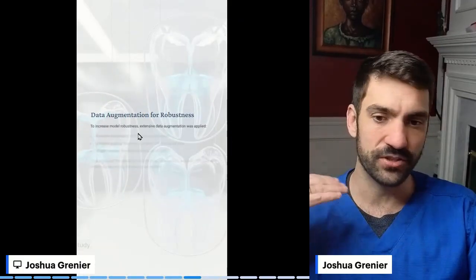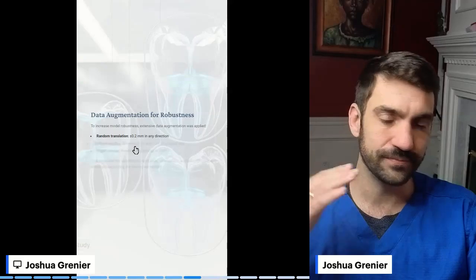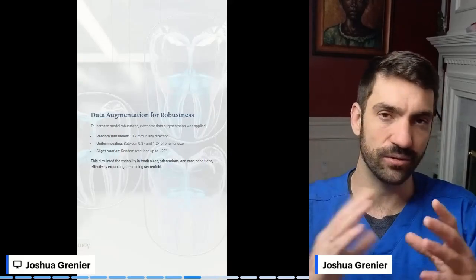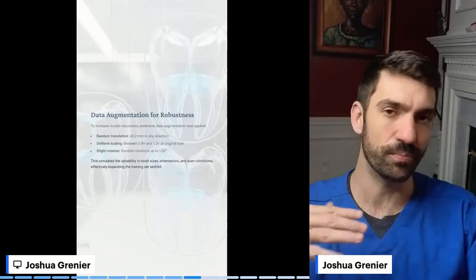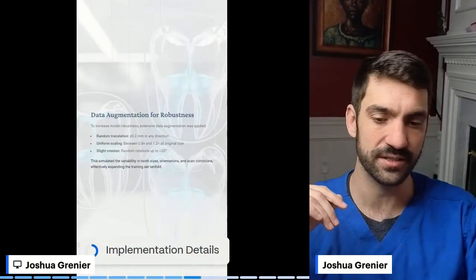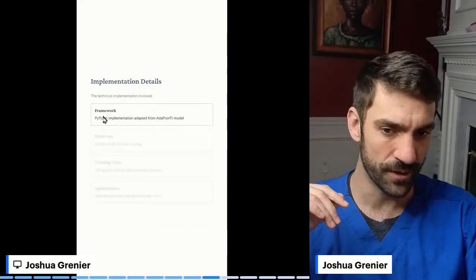And again, they try to stretch the model. They move things around, shake it, twist it, rotate it. And this all seems to shake up the model and increase the robustness, because now all of a sudden, instead of having 300-something training cases, you essentially have much more.